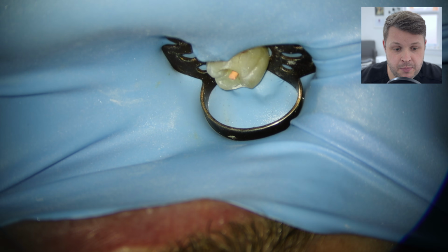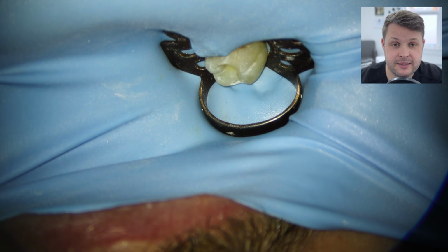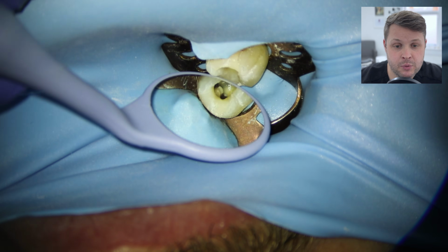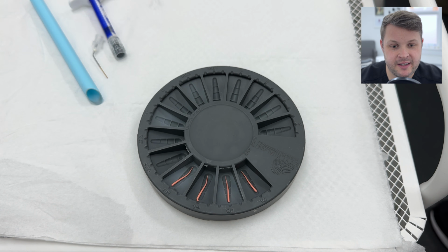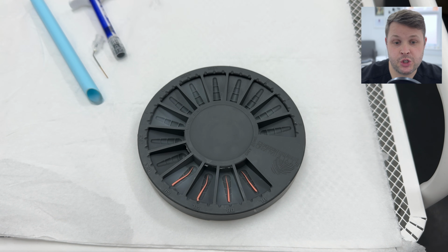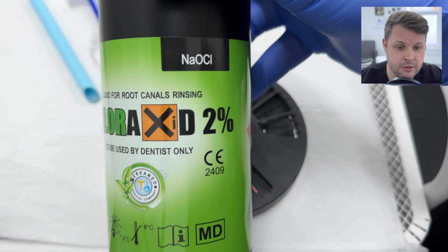You can use Dappen pots, you can use paper cups or whatever. But if we look at my Style Italiano GP disinfector, this is a really, really useful tool, because it is autoclavable. It has wells in the disinfector where you can place your GP points, and then you can fill this up with hypochlorite.